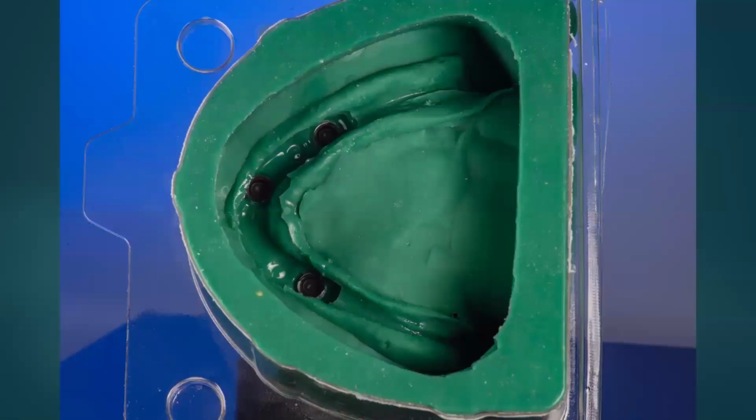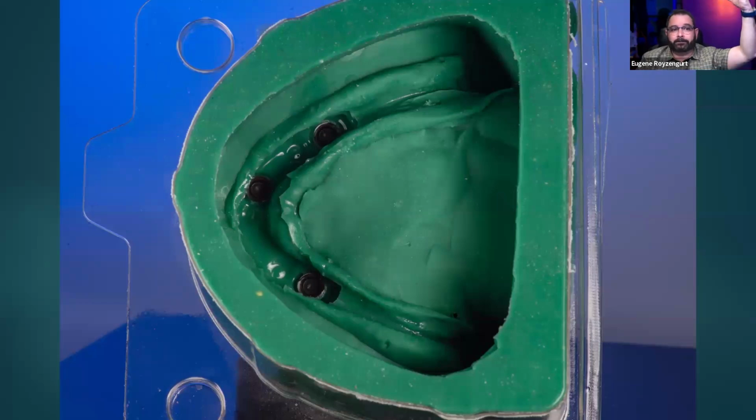So majority of us, if you're dealing with removable pros, for example, are doing some kind of duplication of models. Now, for me, I stopped doing regular model duplication, for example, if you're doing a partial denture and you're processing on a stone cast, and then you need a duplicate to fit that processed denture to. I used to do that with hydrocolloid. And after a while, as you can see on the screen, I started doing silicone. And then I switched over to doing 3D printed.